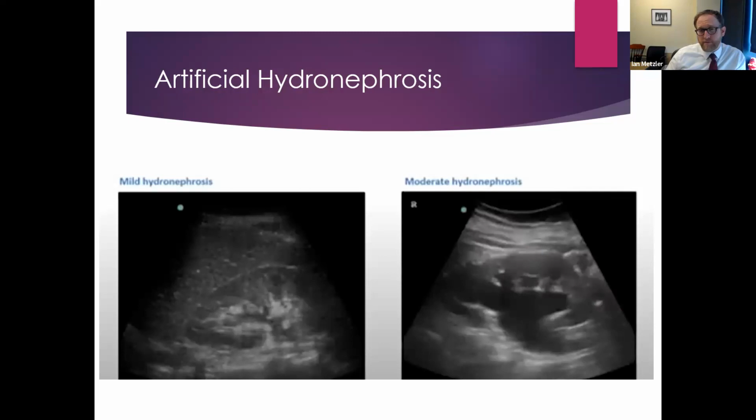And so, you may have had familiarity with sticking a needle into what turned out to be an anterior calyx and really not having a good angle of approach and maybe causing more trauma to the kidney. Well, ultrasound prevents you from doing that. It basically preferentially guides you towards that posterior calyx, and so you worry less about the anterior and posterior confusion between the calyces on fluoroscopy. And I find that that's really important in order to have the best puncture possible.